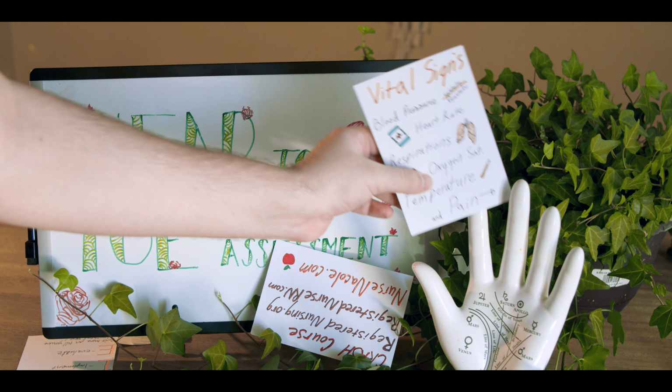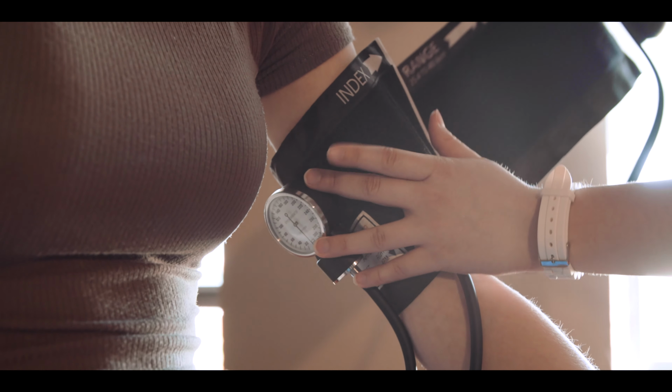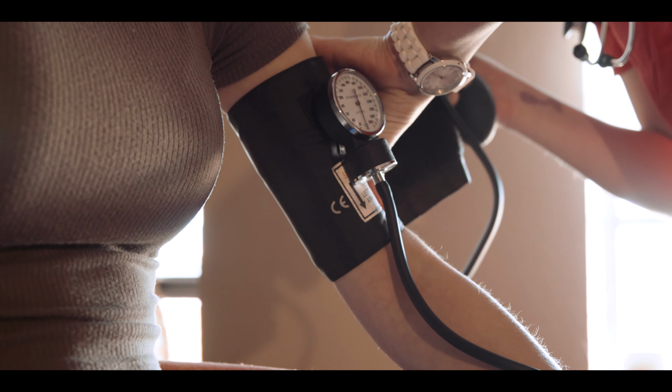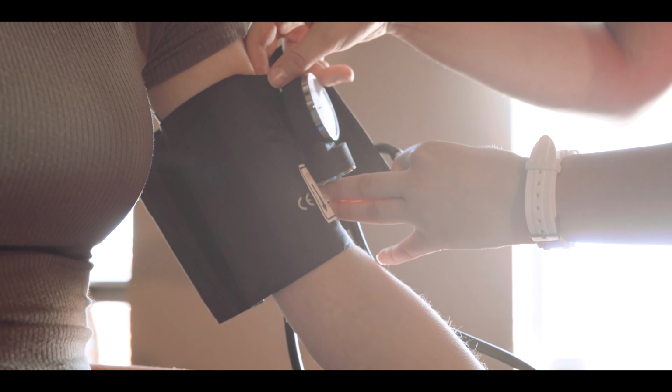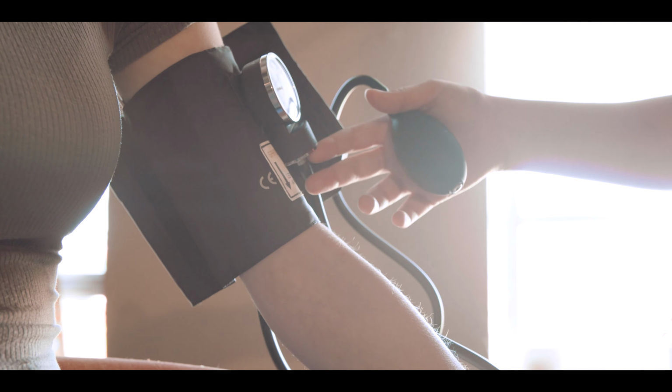The first vital sign that you're going to take is the blood pressure. With the blood pressure, you want to make sure that you get an appropriate sized blood pressure cuff and that it's not in the crevice of the arm, and that you are able to hold the squeeze mechanism and the stethoscope with control and ease. Next is the heart rate.